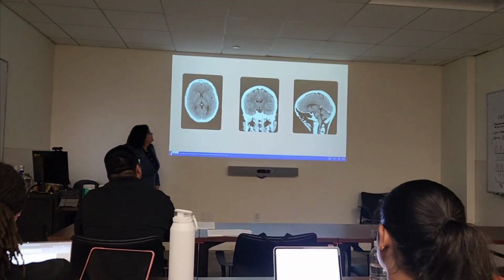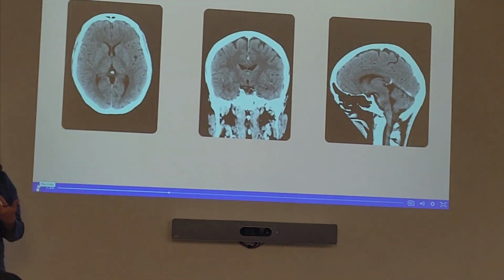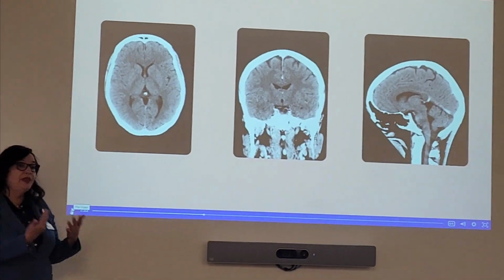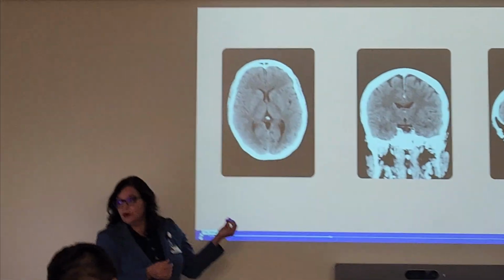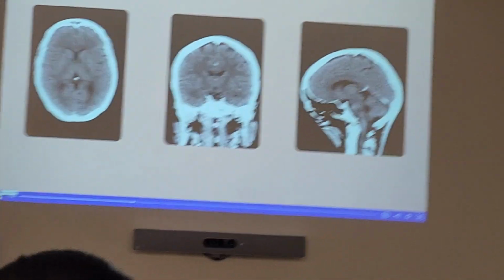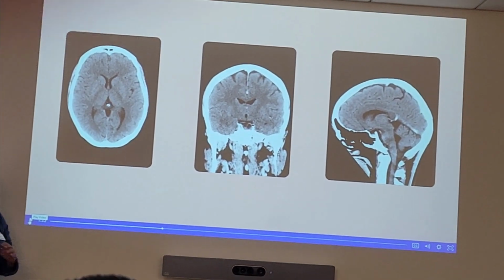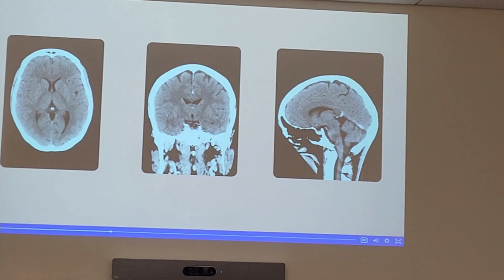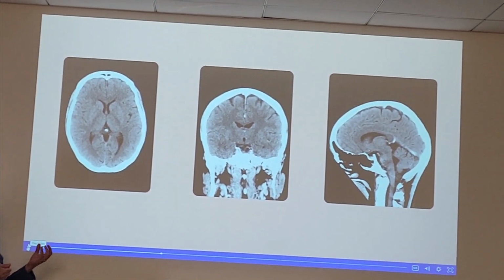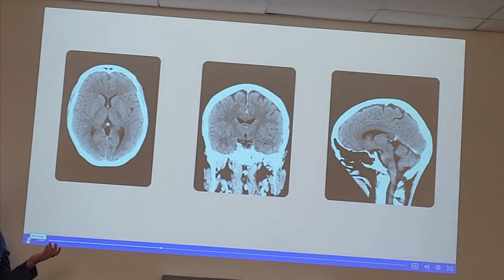So the most common type of exam that you're going to see or hear about in CT is going to be the CT head without contrast. I'll say that again, the most common exam is going to be the CT head without contrast. As you saw earlier, stroke is one of the number one reasons why we utilize CT. So if someone is experiencing a stroke or stroke-like symptoms, we're not going into X-ray to go shoot a skull, we're not going into X-ray to go look at a chest, we're going straight to CT to do a non-contrast brain, okay?